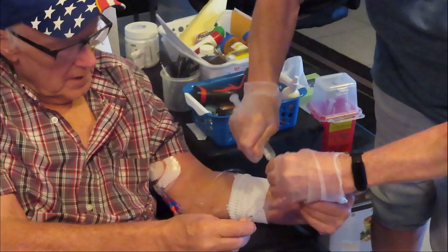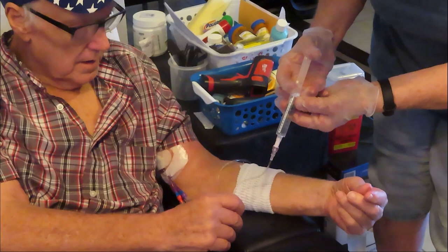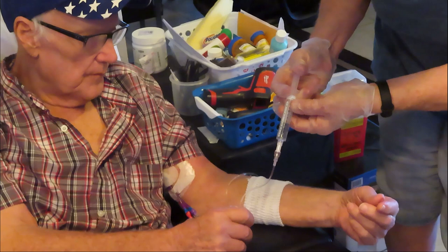Now it's just going to push it in. I like to push it in slowly. Some people like to jam it in. I don't like that. Just push it in, stop. Push it in, stop. Push it in, stop. Okay.